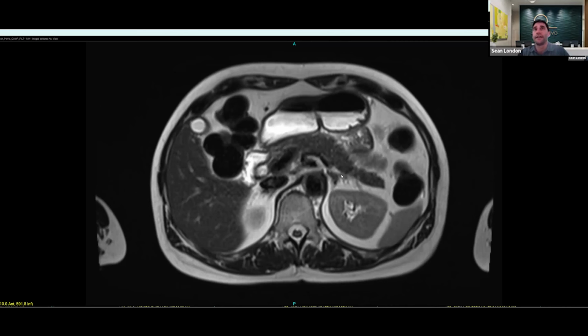If I did see a nodule or mass within the adrenal gland, the vast majority of the time I can actually characterize them using our other image sets that I just showed, the one with the fatty liver and iron. The vast majority of the time, these nodules are something called benign adenomas. They're not malignancies, but they can secrete too much hormone if they're functional. The way we can characterize them is to look at that other image set, and if the nodular mass gets darker in signal intensity, that's an indication that it contains fat, which is consistent with an adenoma. So that's how we can characterize those on this test.